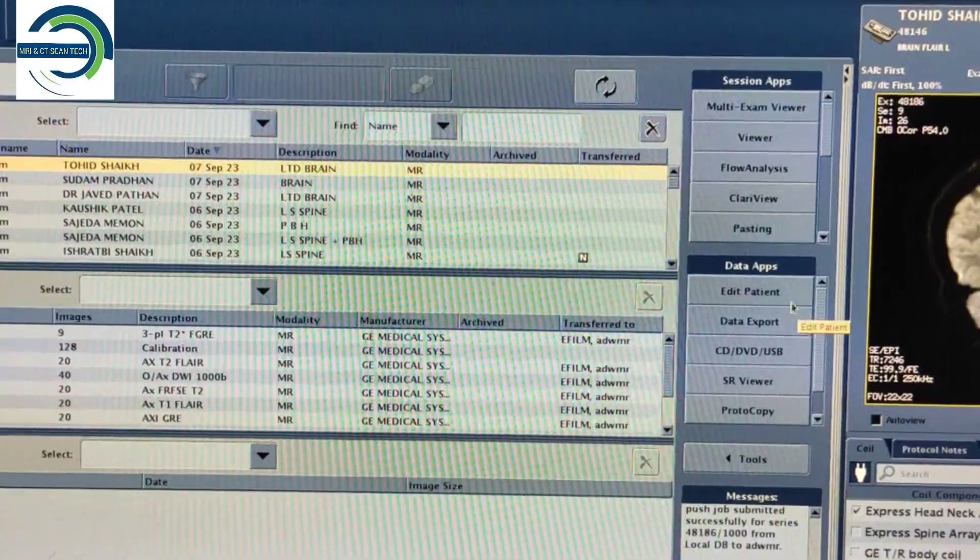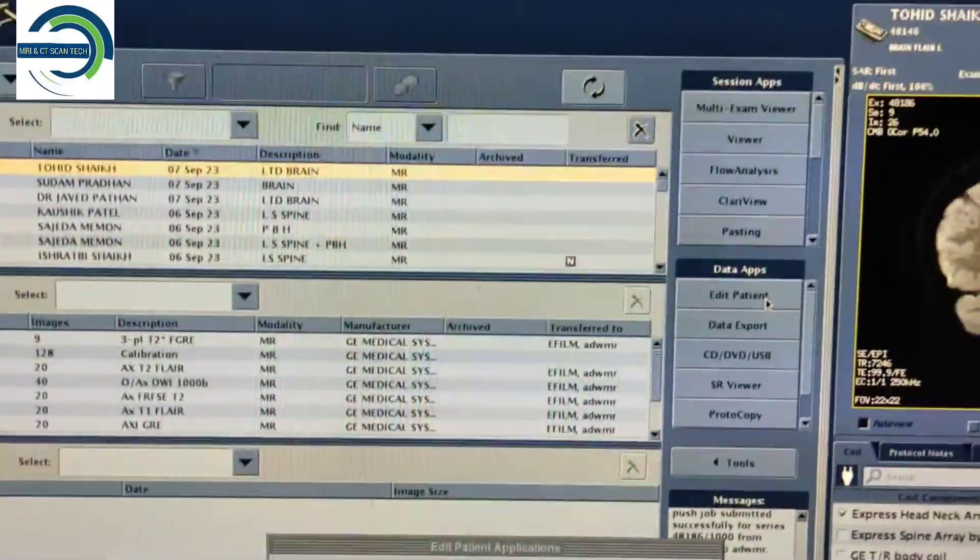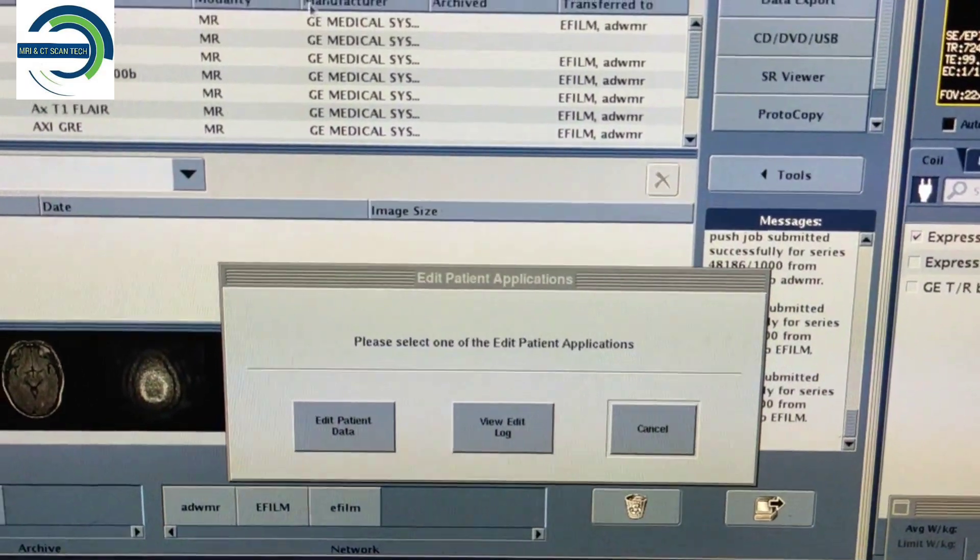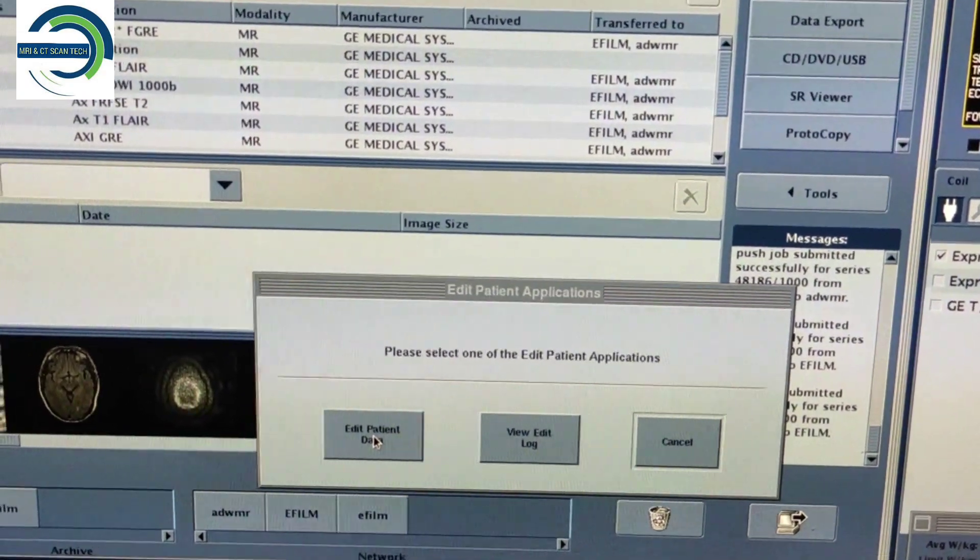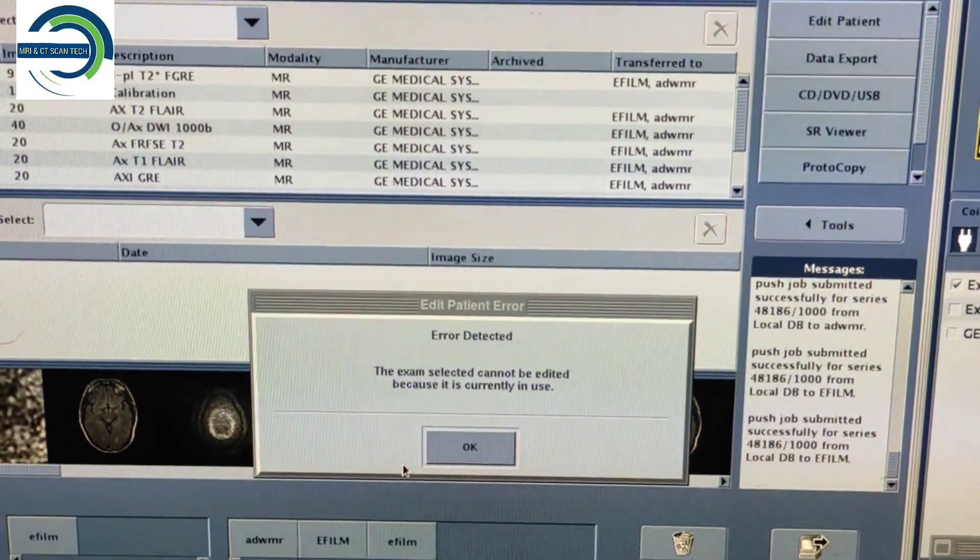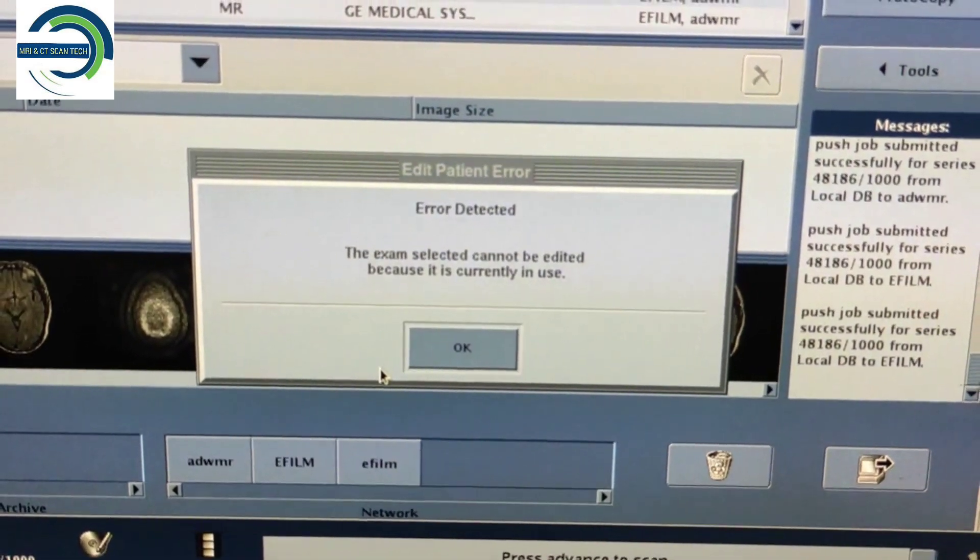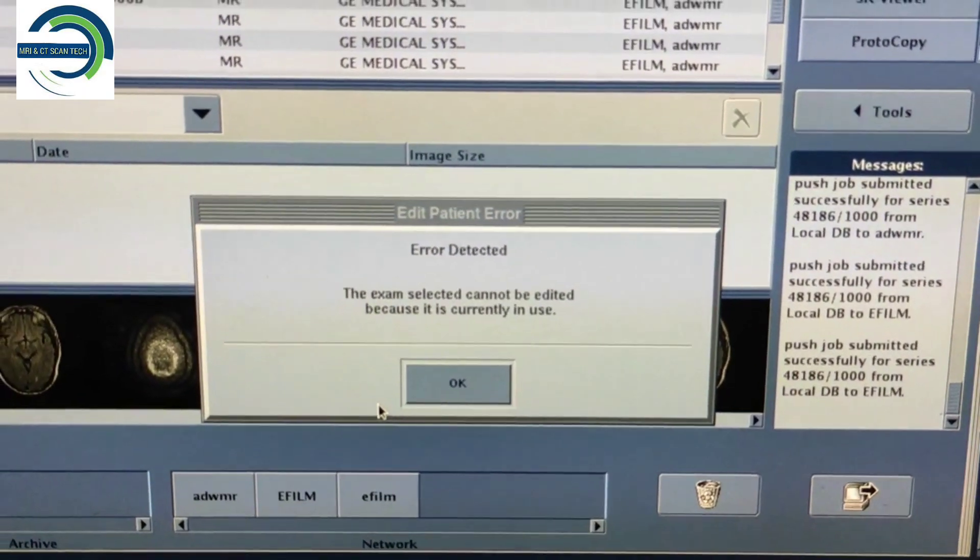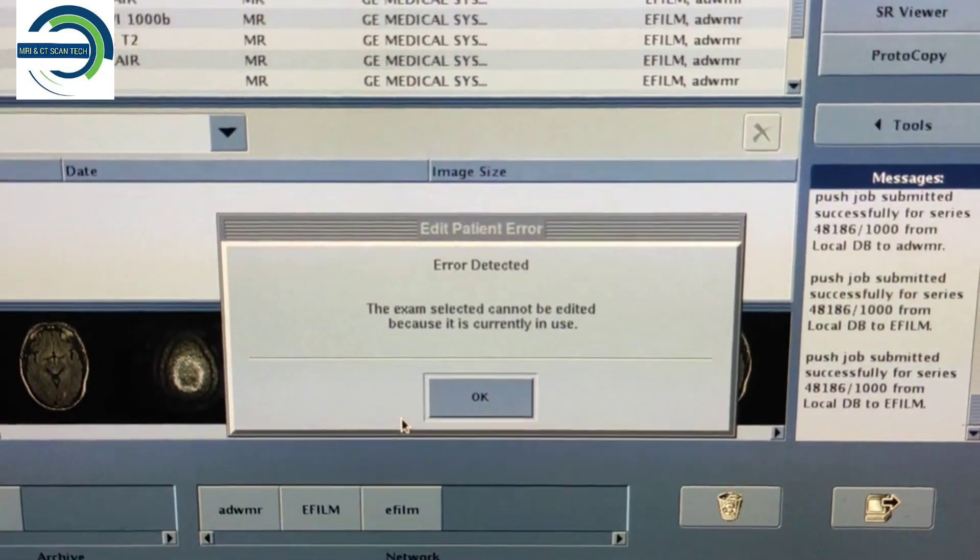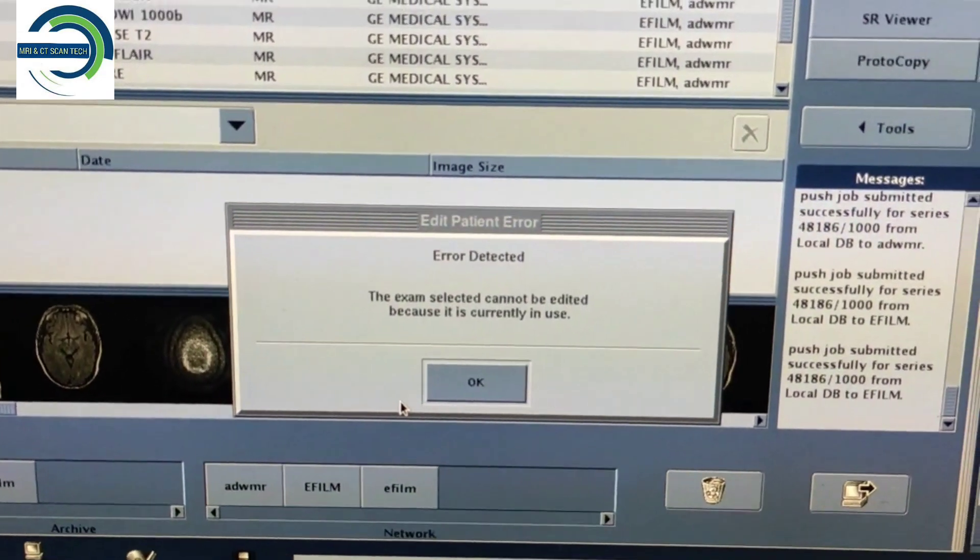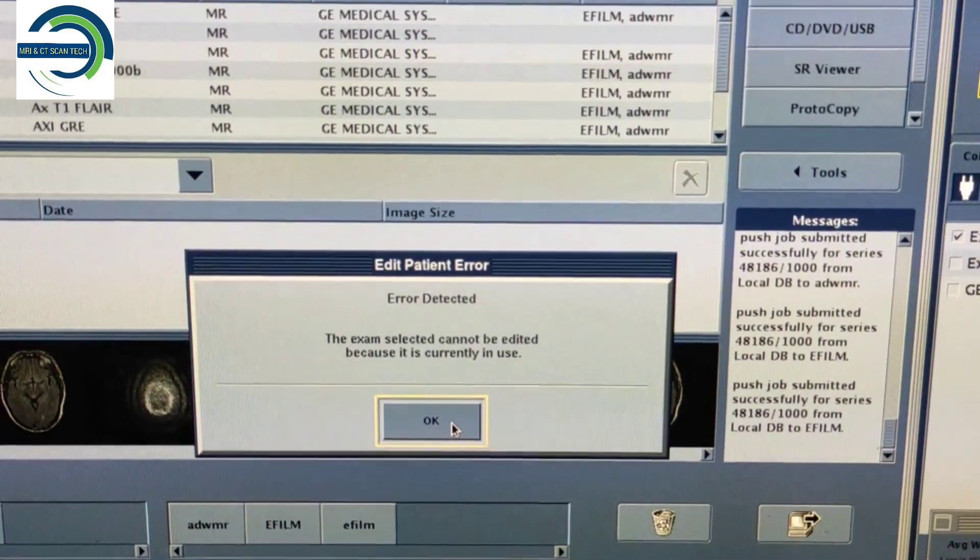Then select Edit Patient. This will open, now you have to click on Edit Patient Data. Now you can see an error detected: the exam selected cannot be edited because it is currently in use. In this situation, you have to click on Okay.